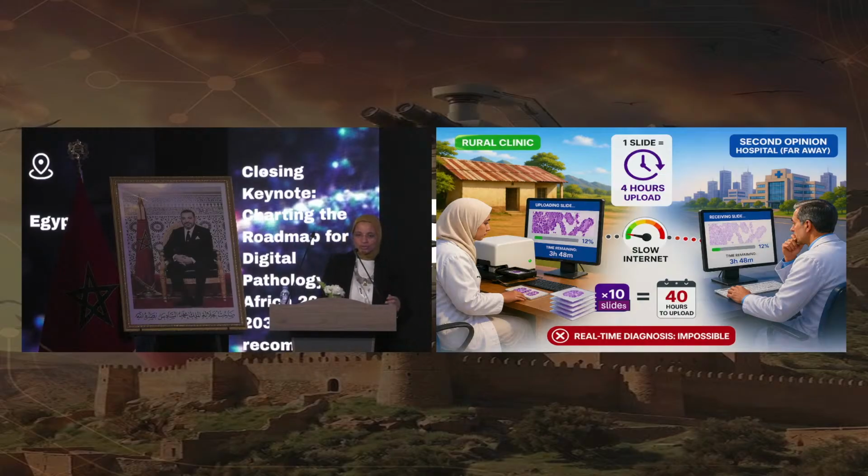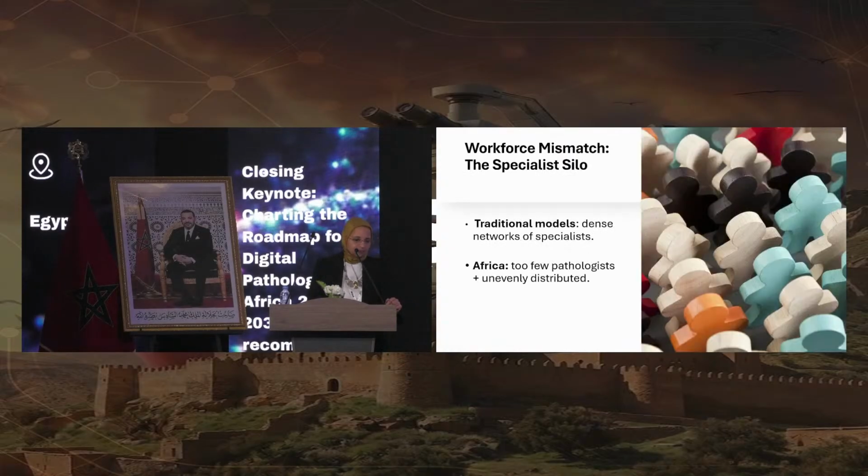In the first place, it was granted to them, but as you see, it took her this 2 gigabyte slide, it took her 4 hours. And the margins and the things, we needed at least 10, for example. It took us 40 hours for the professor, who is composed and patient, waiting 40 hours to give an intra-operative decision. This cannot be, this cannot be. So this is us again.